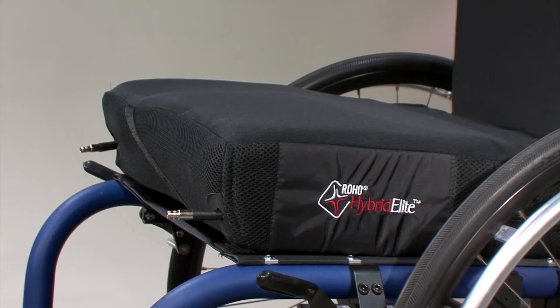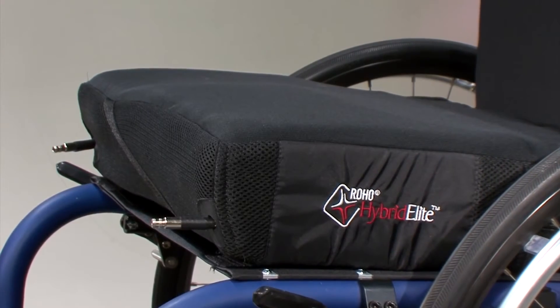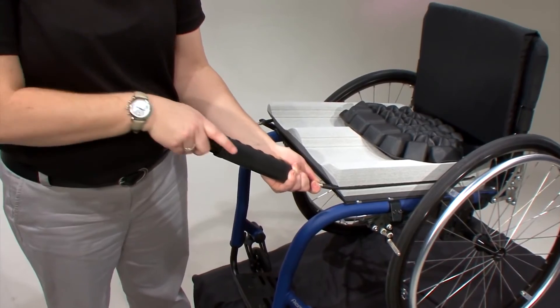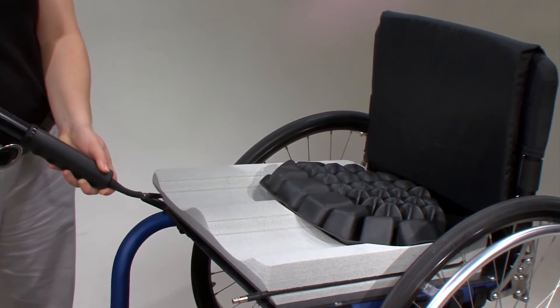Roho recommends doing a hand check daily to ensure the cushion is properly inflated. If the suggested distance has changed and there is more or less air in the cushion, make adjustments as demonstrated. Dual compartment cushion inserts may be used for side-to-side positioning. To maximize the positioning benefits for individuals with a pelvic obliquity, the side with the deepest bony prominence must be adjusted first. Once both adjustments are made, recheck each compartment to ensure proper adjustment.